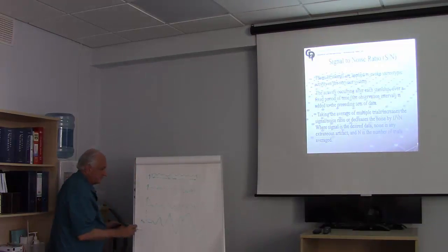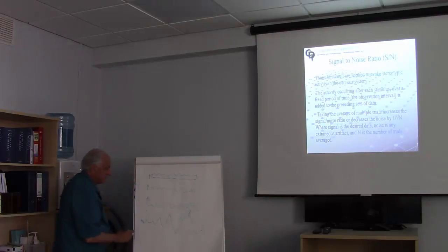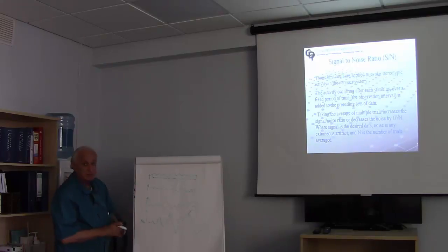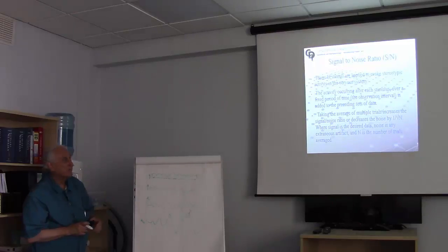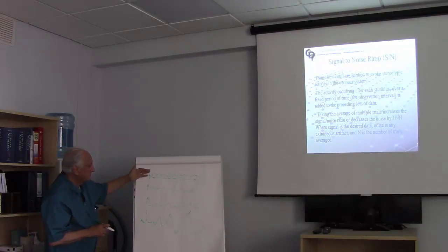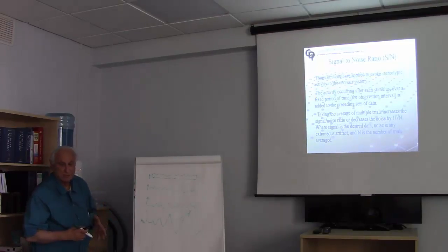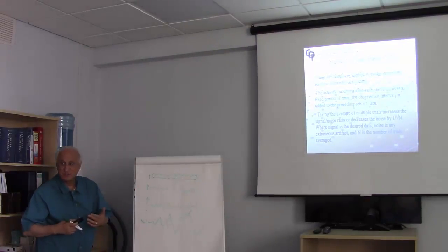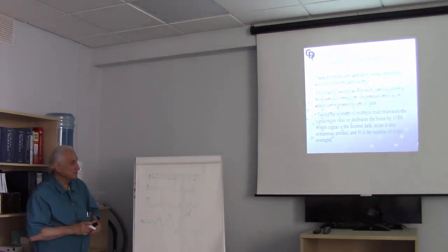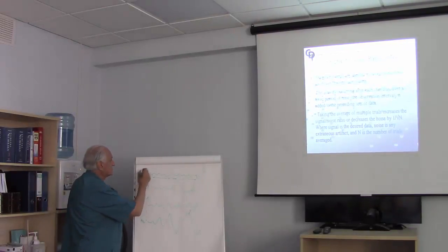Okay, and this would be wave 5, say. So when you average these all together, that's the signal you want to pull out. That's the idea of getting a signal out of the noise. The noise is actually this background EEG activity, which in reality isn't noise, but we call it noise for signal extraction purposes. So to pull this signal out, you have to make several assumptions.